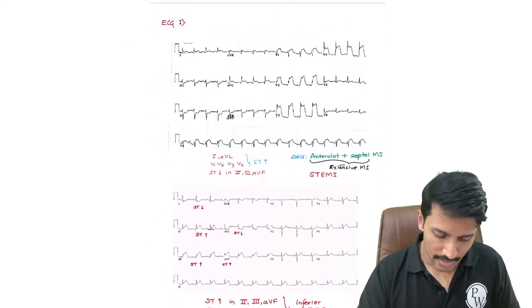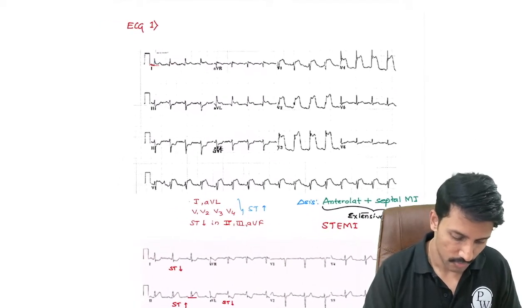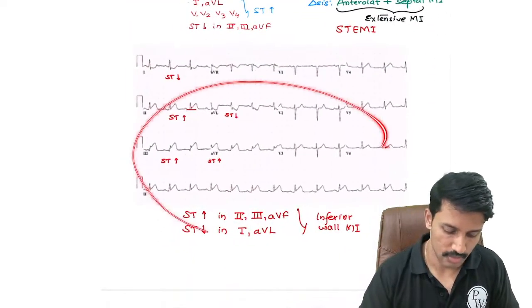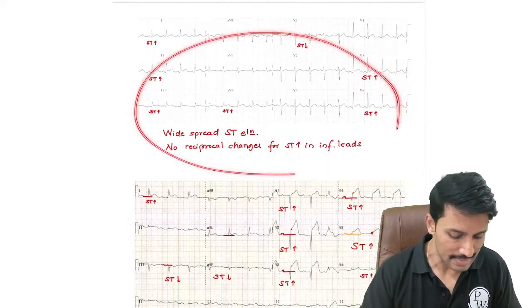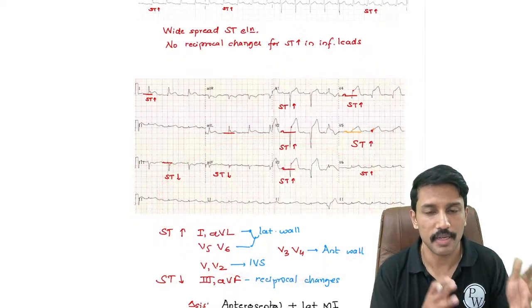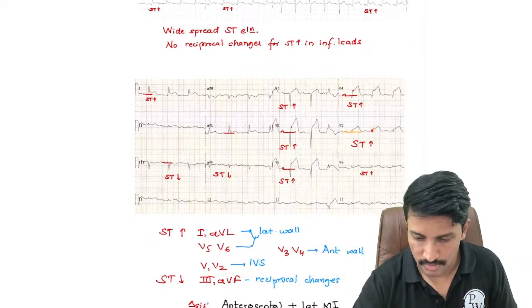Okay. So now the last bit we need to learn today is, we saw that this patient has an MI. We know the anterior wall is affected, the lateral wall is affected, the septum is affected. Here only the inferior wall is affected. Here it's not MI. Here again it is extensive. Can I identify which blood vessel is responsible?